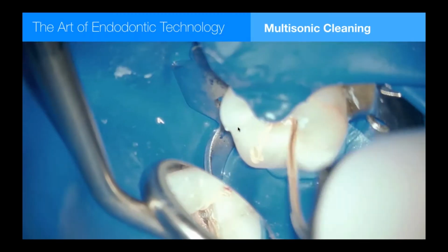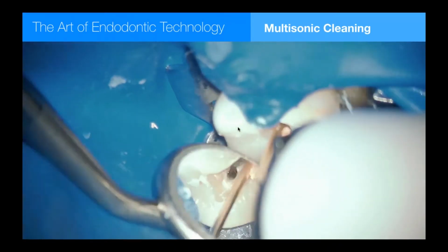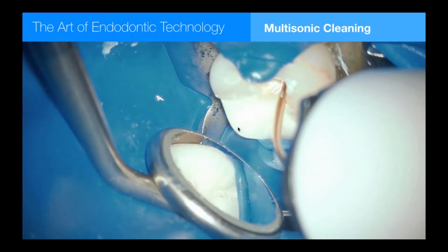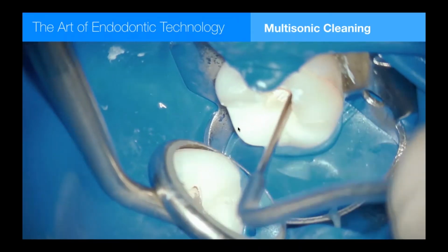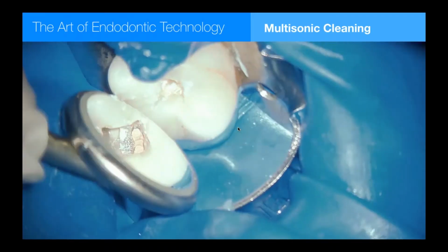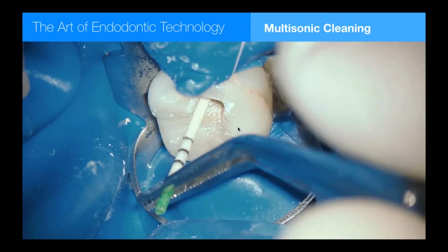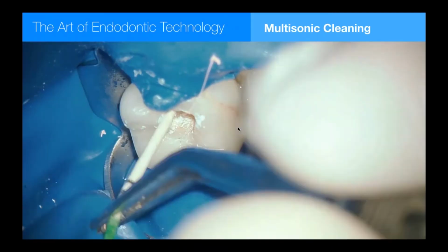I'm going to put the needle back in the adjacent canal. 1001, 1002, 1003, 1004, 1005. Push the button. It starts syringing out the end. As soon as it backs the needle up, I bring the small end of the blue plugger. It's 0.7 millimeters. It fits because it's the same size as the needle in the extruder. I backfill to the orifice level and then cut off all the extra around the orifice with the edge of the plugger. And I have a nice smooth surface to put my post-endodontic restorative effort up against. Now I'm drying the canals in the mesial root.